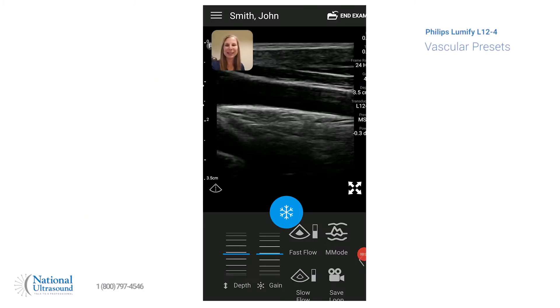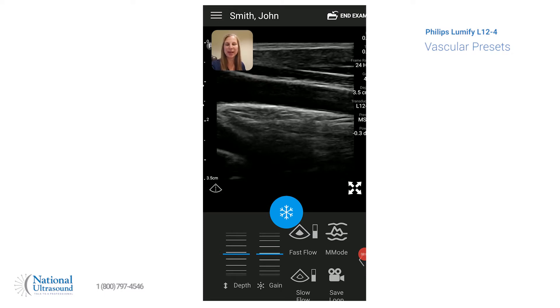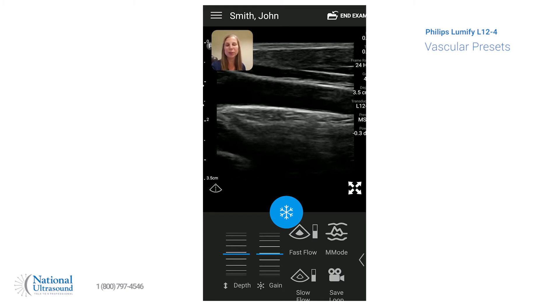Hi, my name is Jackie Klebeck. I've been a registered vascular, cardiac, and general sonographer for eight years. I'm here today at National Ultrasound on a Philips Lumify L12-4, and today we're going to show you some of the features while in the vascular preset.